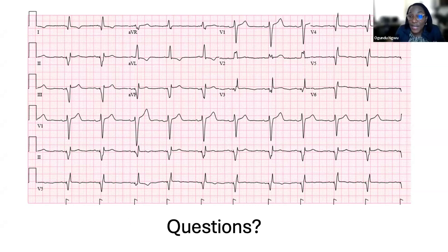Okay, sure. But again, I think it's really a matter of what works. These are things that are not etched in stone. Once you have phrenic nerve stimulation, and if it's running right along all your poles, it can be very frustrating because you may have a very nice location, and then if you go to a different place, it's all scar. So oftentimes you're just trying to see what works, because people cannot tolerate phrenic nerve stimulation. It's very unpleasant and uncomfortable.